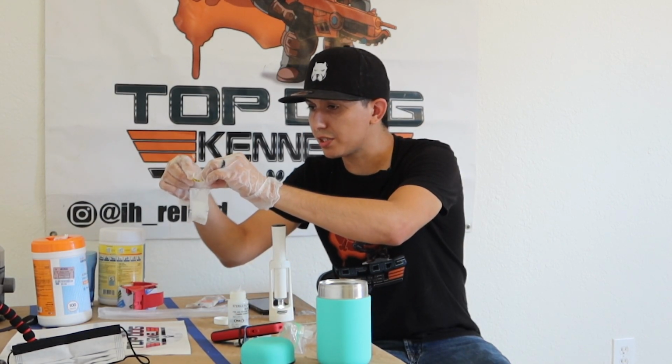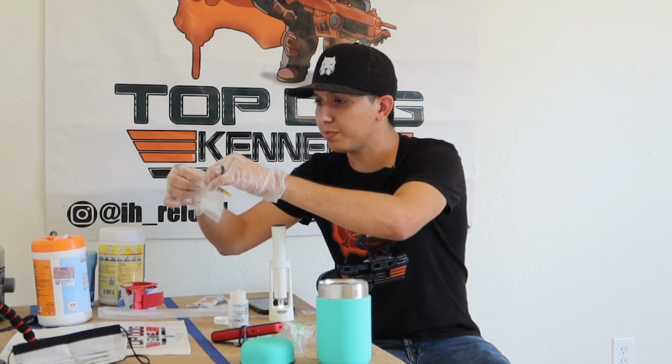You want to just package this up. You package it up and you mix again.